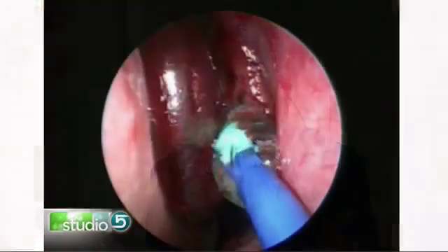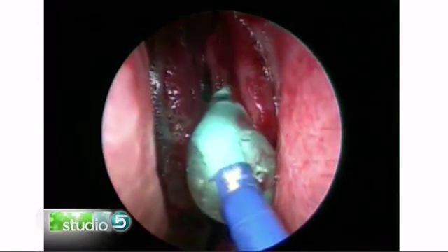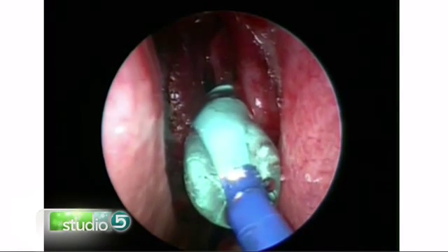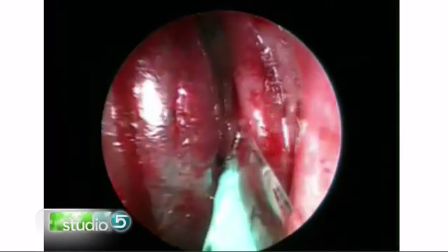Yes, it's not a new technique. It's been around for 10 years, but really it's gained popularity in the office setting in the last 5 years. And essentially what happens is a catheter is placed in an obstructed sinus and a balloon is used to dilate it. Okay. And it's done under local anesthesia, very similar to what a balloon angioplasty does for people with heart disease. This does for the sinus sufferer. It opens up the passage. Oh, wow. So therefore now you have permanent opening and ventilation. We are seeing it happen.